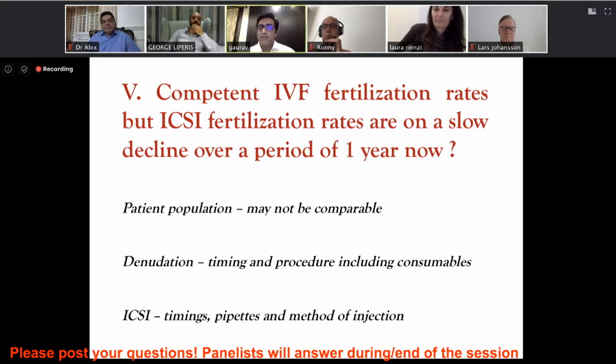So we're not undertaking troubleshooting where something happens immediately, but over a year, the ICSI rates are slowly declining, whereas the IVF fertilization rates are fine. They're doing great, because we've gotten such queries before. So how do you think this situation differs from what George is talking about?